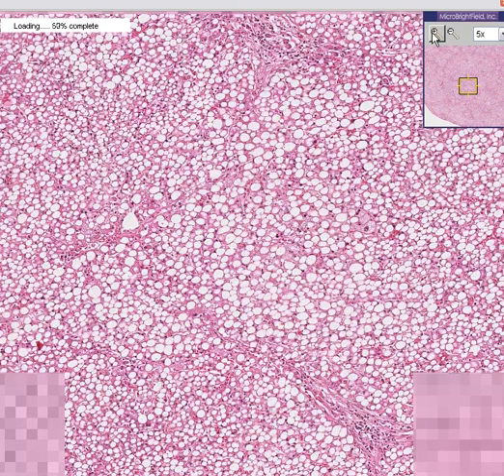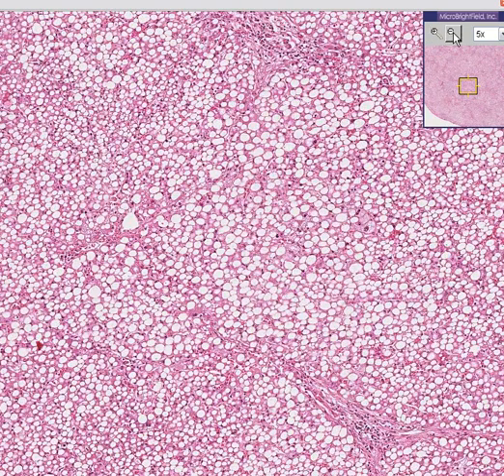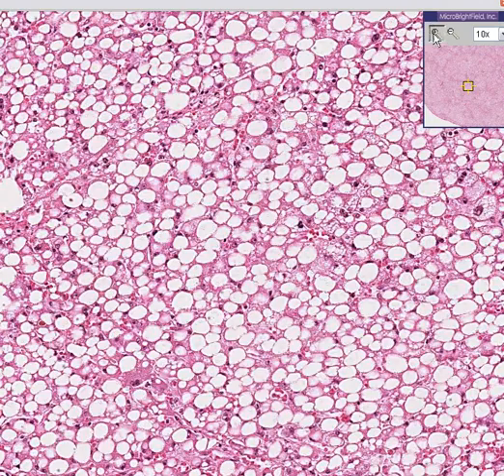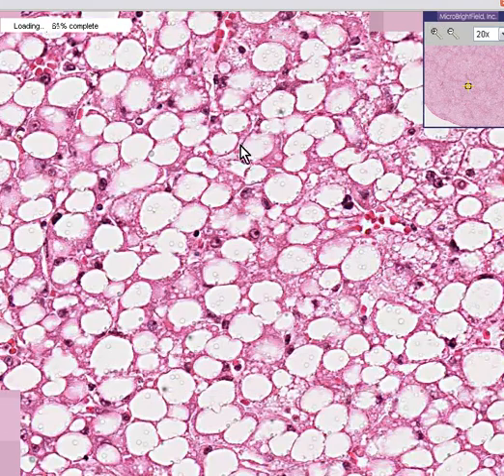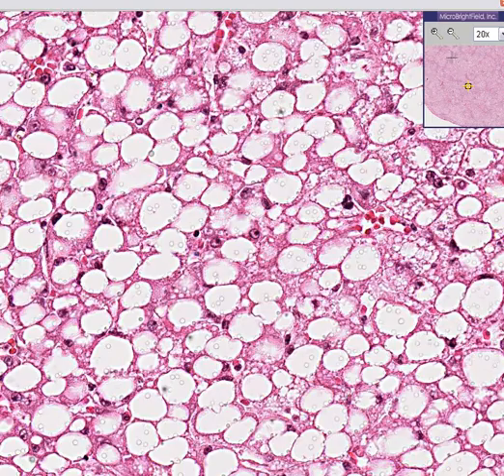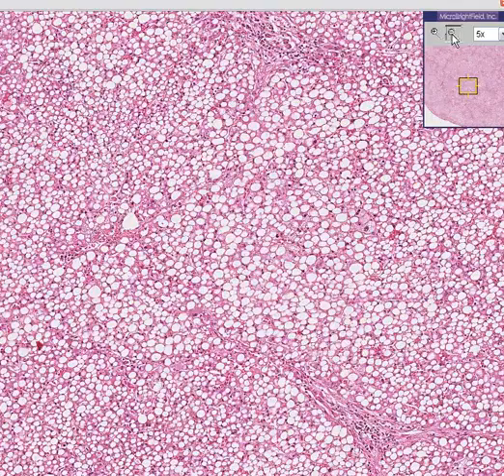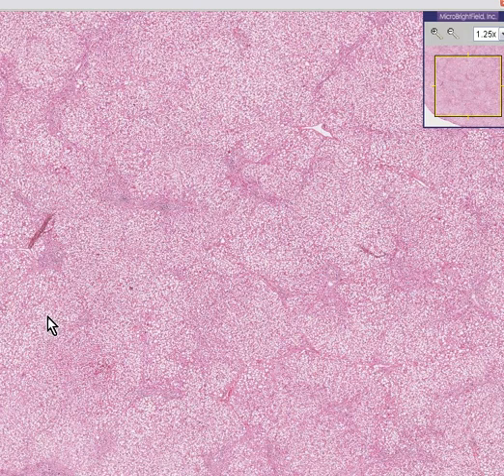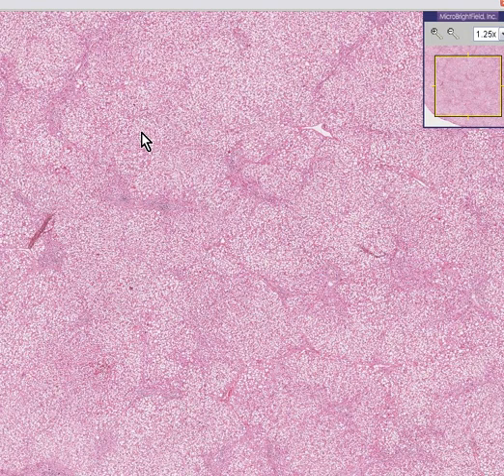Notice that even though this liver is terribly, terribly overloaded with fat — which is what all these spaces are — predominantly macrovesicular, but some of these little vacuoles within cells are microvesicular. Notice that even though it's overloaded with fat, the so-called portal hexagonal architecture is still preserved.